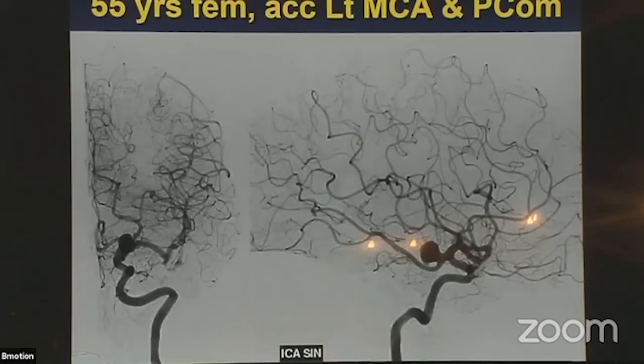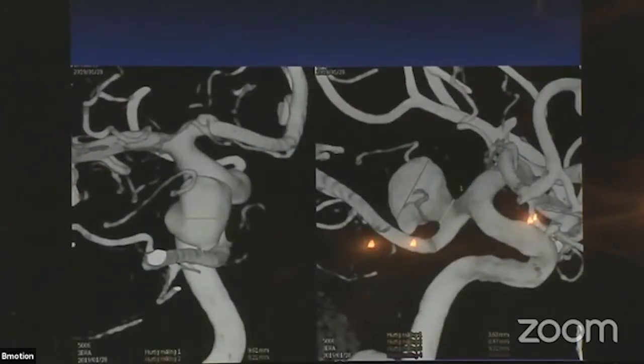Next case — also learning curve. A 55-year-old male with two aneurysms: one left MCA, one PCOM. The surgeon wanted to clip both but could not clip the PCOM — he said it was too low. It looks like this, and check the measurements — the largest device should be used for up to 8.5 mm, but this aneurysm is larger than 8.5 mm. The company said it was probably too big for the largest device, but I said let's try it on my responsibility.